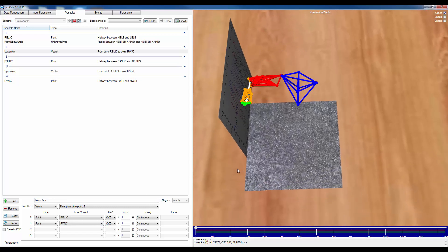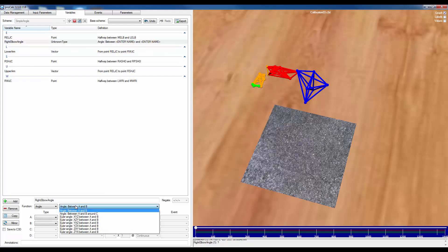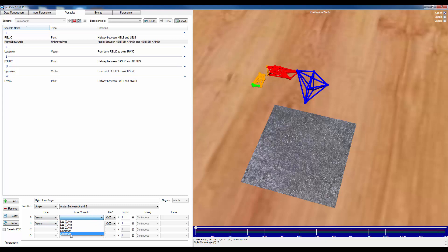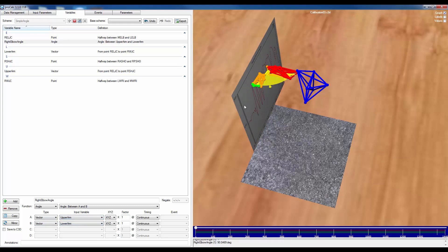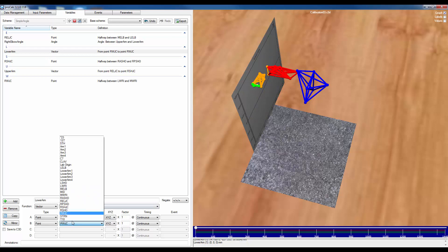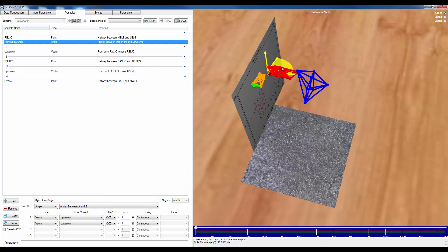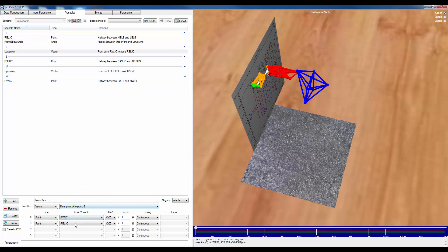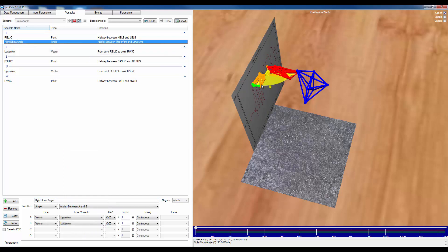Coming back into right elbow angle, I select A to B and choose the upper arm and lower arm vectors, and you can see the angle being calculated. The preview allows me to verify I'm calculating the angle I want. To demonstrate — if I swap my two points for the lower arm, changing the direction of the vector to right wrist joint center to elbow joint center, you can see it calculates the wrong angle, almost the external angle. So I'll come back into the lower arm and fix that back to right elbow joint center to right wrist joint center, and the elbow angle corrects itself.